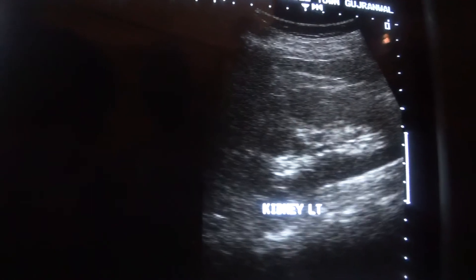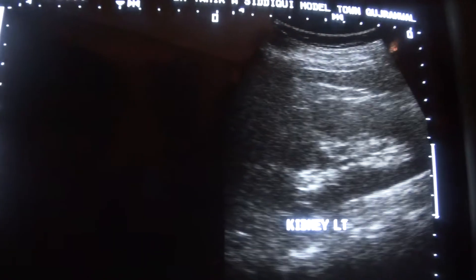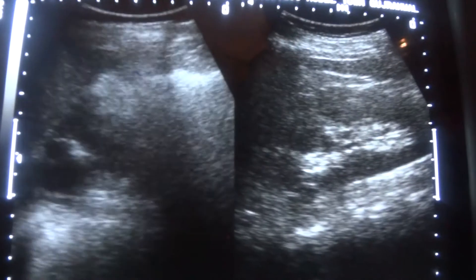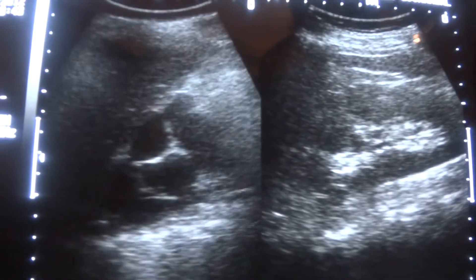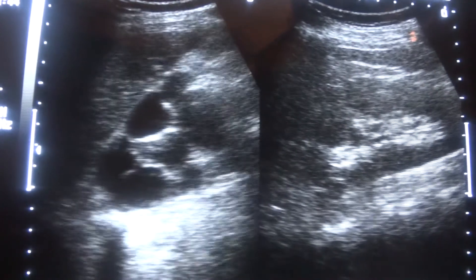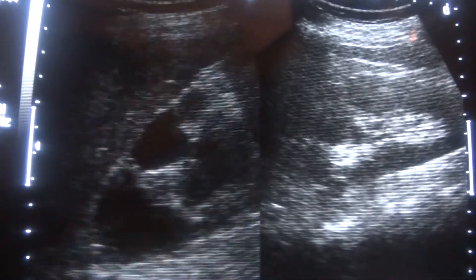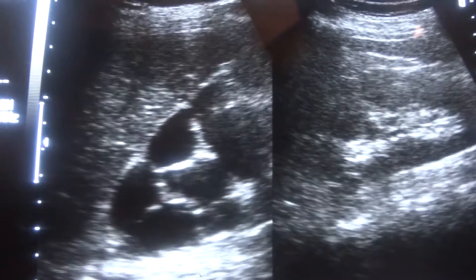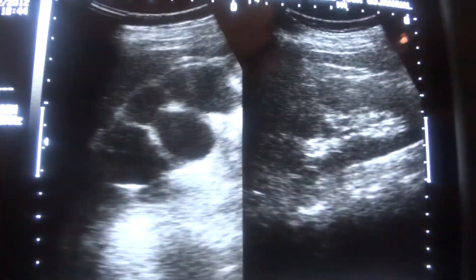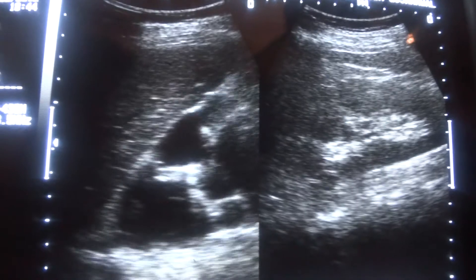Now, keeping in view this left kidney which is normal, I am going to focus on the right kidney of the patient. This is the upper pole of the right kidney.